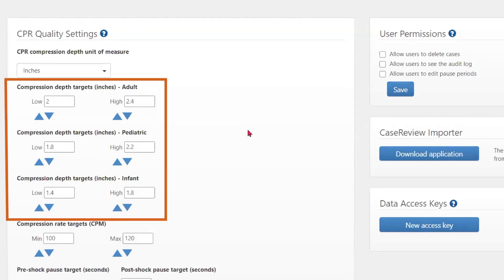The CPR targets for adults, pediatric, and infant can be set using the blue arrows.